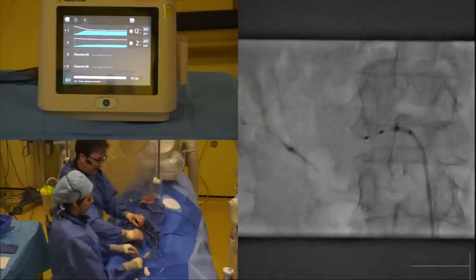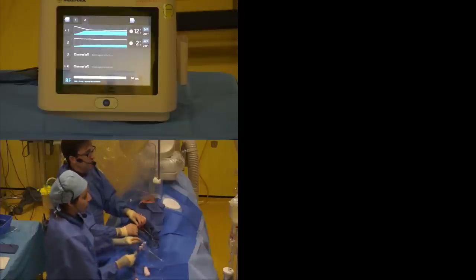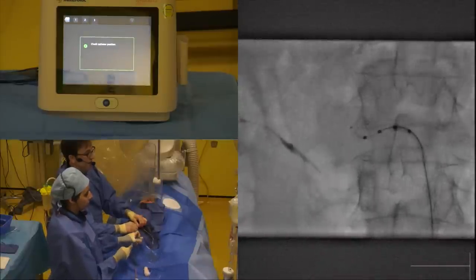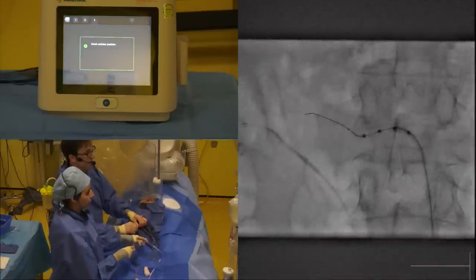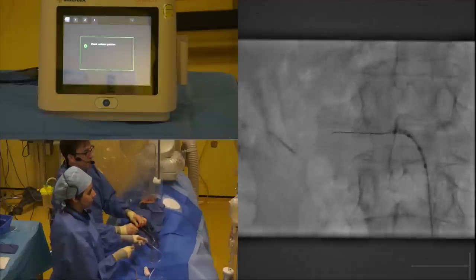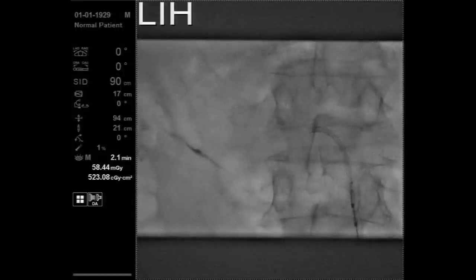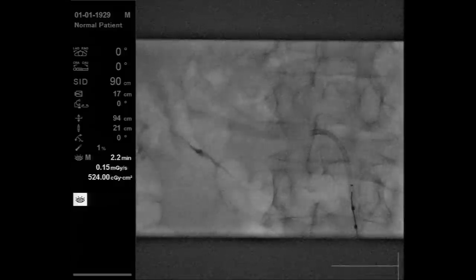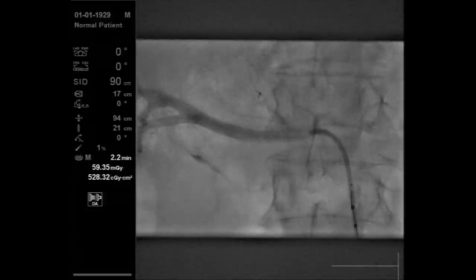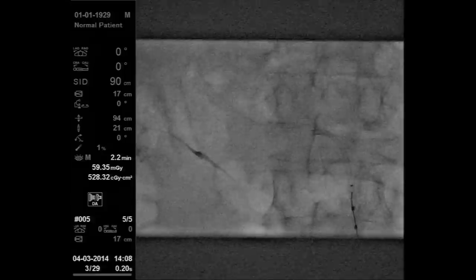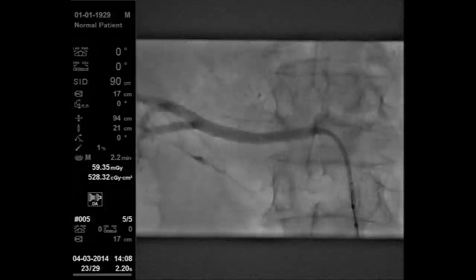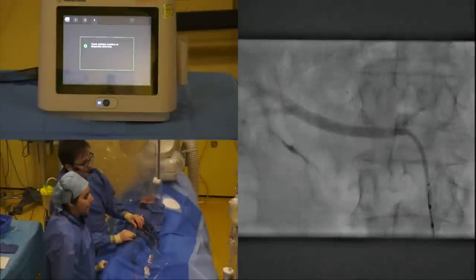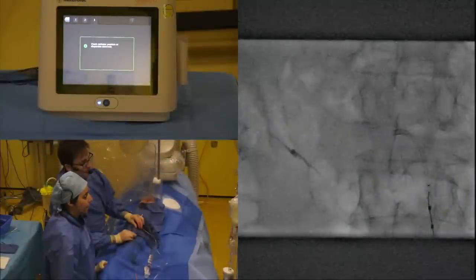I'm not really going to worry about this. We already had four textbook ablations distally. We've got a fifth approximately now, and I'm very comfortable here. Would you agree with that? Yes, absolutely. I'm just going to re-advance my wire now, and then we'll just do a very quick check angiogram picture here. Just straighten things off, pull everything back together, put my wire back, and then that's back in the catheter. Okay, and inject this, Rush. A little bit of dimpling, I think, but again, the vessel looks intact. There's no major spasm, no significant problems. Do you feel comfortable with that? That's great.